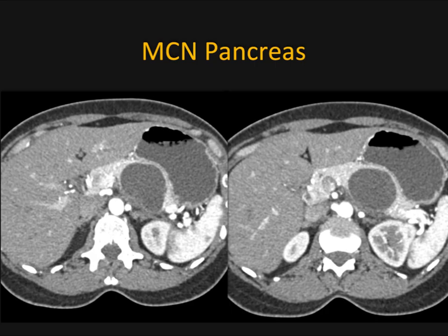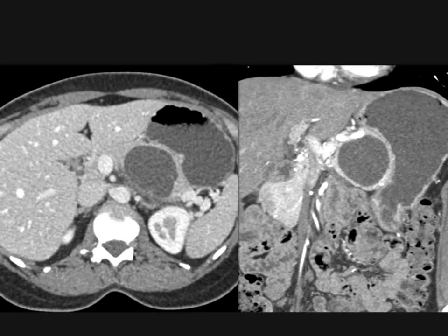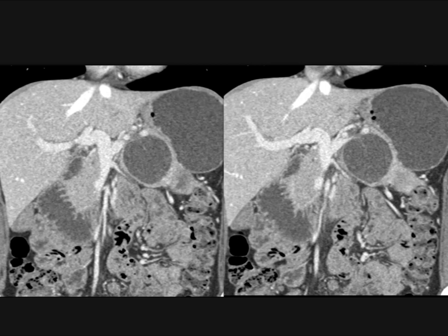Another case: a well-defined lesion in the body of the pancreas, no dilated pancreatic duct. On axial images it almost looks a bit exophytic, but on the coronal view you can see it's sitting right in the body of the pancreas and pushing on the stomach. This patient had some abdominal pain and fullness after eating. Looking at the multiple images, this is a very classic lesion, and if you look hard you can see a septation.